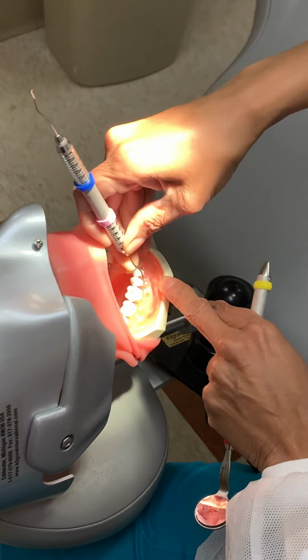Also, you want to make sure that your tip third, and we talked about that too. I talked about the tip of the instrument. Make sure your tip third is always adapted to the tooth surface. So this is your tip third. So hopefully you can see there. I'm just going to go back over that. Start at the premolar. I'm going to just hit this tooth. Let's go back to the molar so you can get a good feel of what I'm doing. Distal line angle.